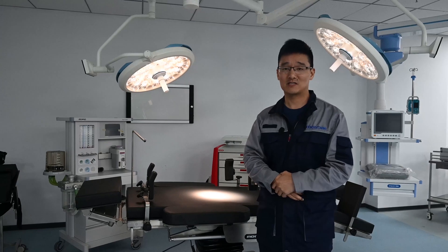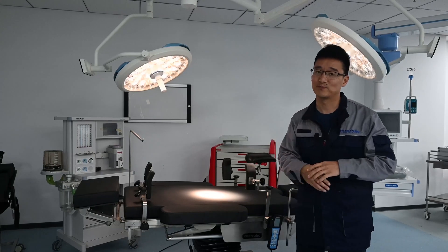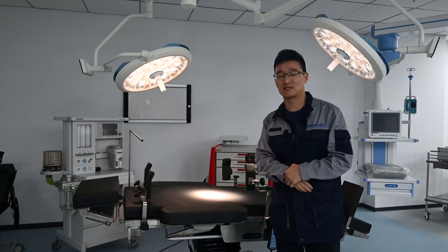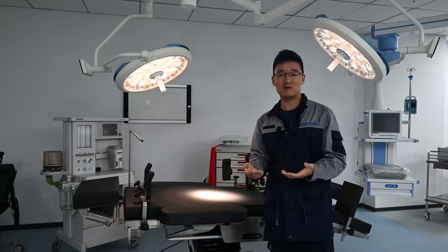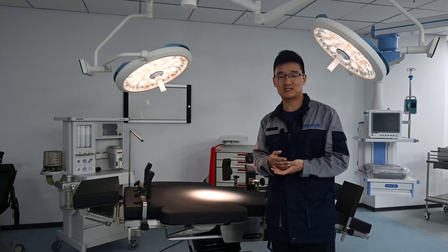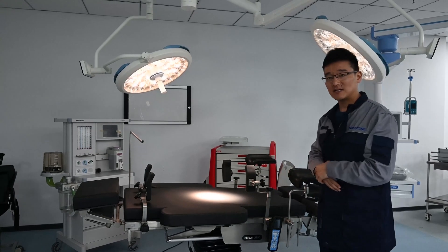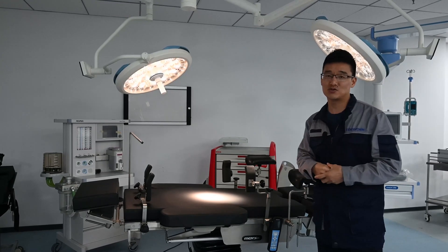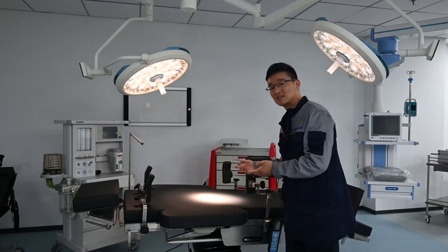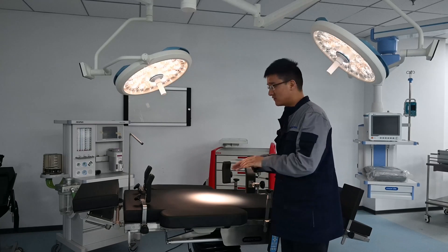The second important index for the surgical lamp is color temperature, and it's especially important that color temperature be adjustable. Color temperature is measured in Kelvins, sometimes called K for short. Generally, red and yellow colors are low Kelvin, while white and blue colors are high Kelvin. Different color temperatures reflect the virtual color of organs and tissues to different degrees. Higher color temperature can better reveal the actual color of organs, helping doctors identify different tissues more easily.